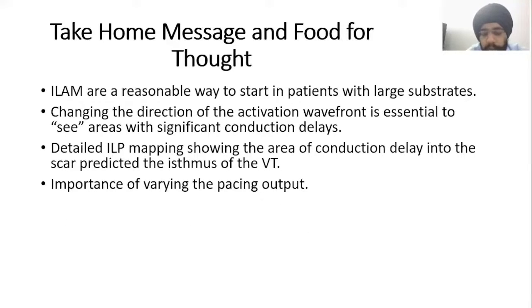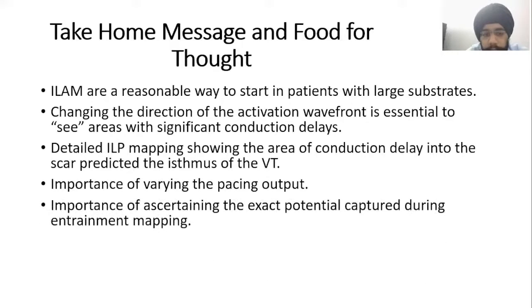The case highlights the importance of varying the pacing output, as at lower outputs we were not able to capture the mid-diastolic potential, which we were able to do at higher outputs. And of course, the importance of ascertaining the exact potential captured during entrainment mapping cannot be overemphasized.